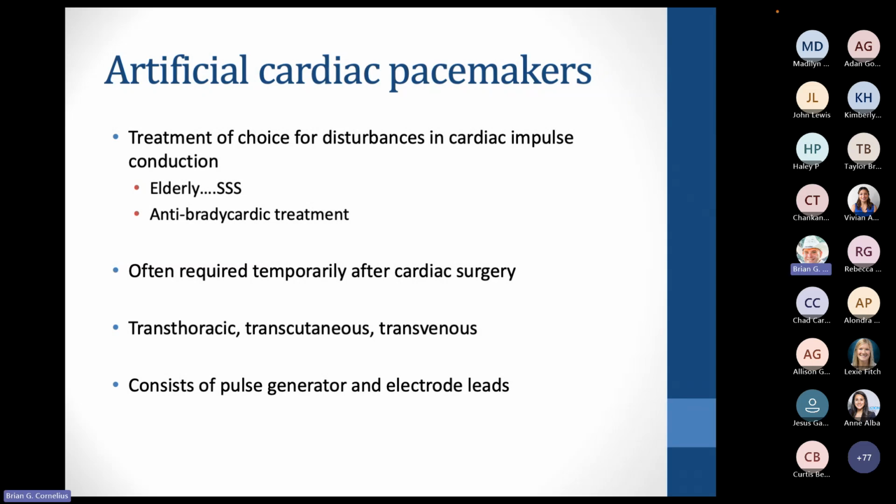So whatever setup you're using, you're going to have a combination of leads, whether they're leads as basic as a sticker on the chest or implantable leads, and then some sort of pulse generator that actually provides the electricity through those leads. So it may be a Zoll that's providing your pulse generator, or it may be an external device, or it may be the implantable device as well.